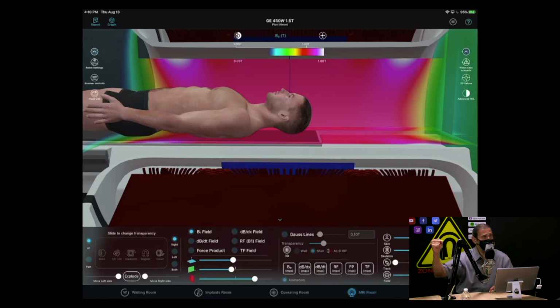Torque is tremendously strong because it's a very strong magnetic field, but translation is essentially 0 because it's a homogeneous field in the center. Now, as you try to get to the center, oh my gosh, here it's much stronger than here, and here it's even stronger than here. That's what makes it translate and head in that direction. So where are the differences in field, dB/dx? Because that's going to be predominantly telling you the translational forces.